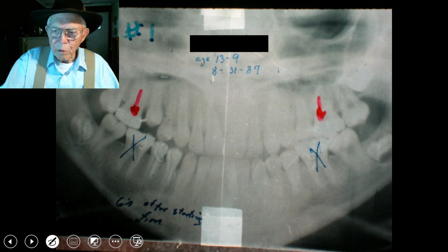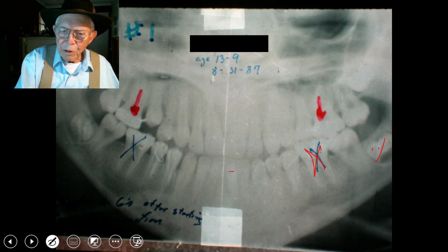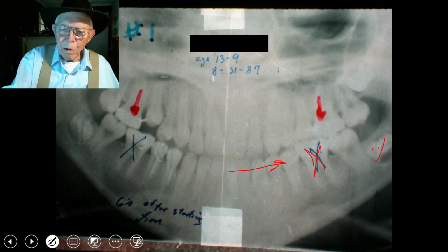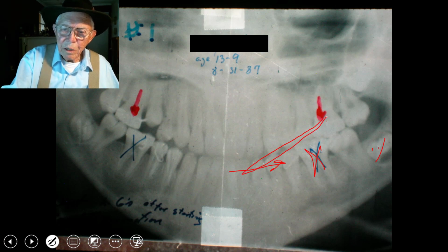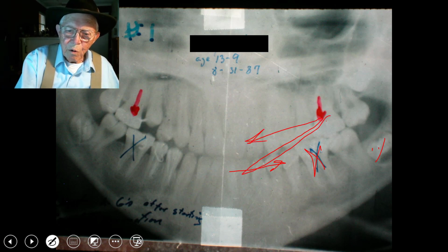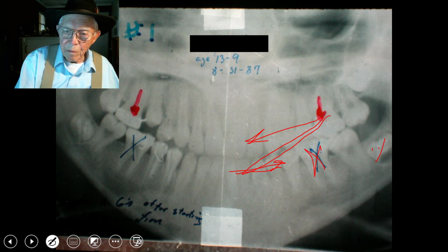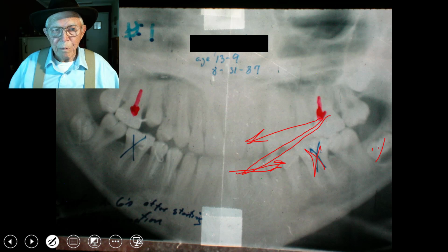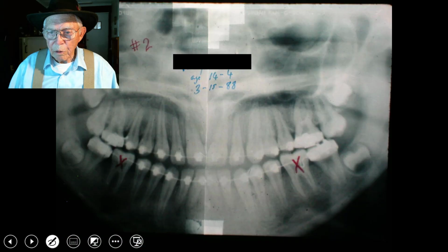Now here it's going to show our x-rays a little bit better. Now you see we've got wisdom teeth. Here we want to say we're going to extract this, and we're going to back this up to some extent, and we're going to come off with class 3 elastics, and we're going to bring these teeth forward up here, and then some of this will be bringing this back the same way, closing the space up there, how we close that. Now let me go on here.